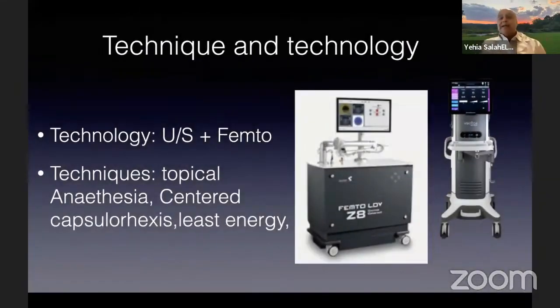We are improving in our techniques. We can use very advanced ultrasound. Phaco machines now are very efficient, very safe. And also we can introduce the femto to cataract surgery for certain steps in the procedure that can help us to get an outcome that we can promise the patient.